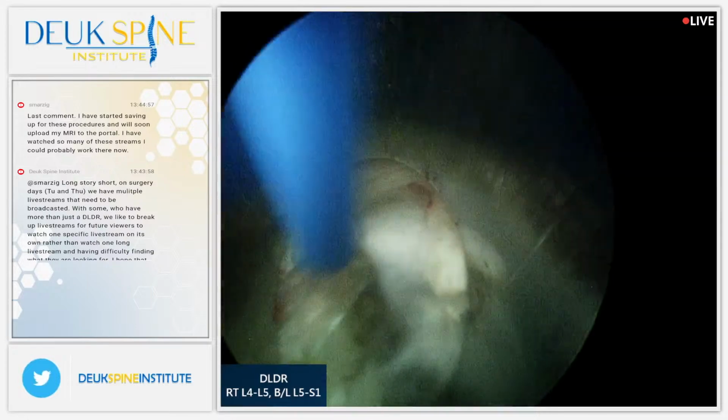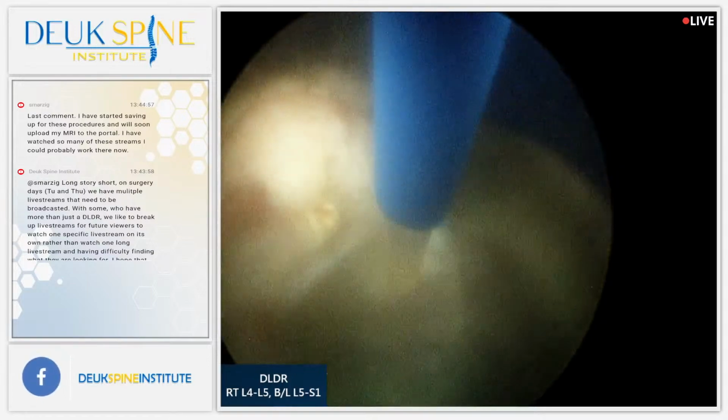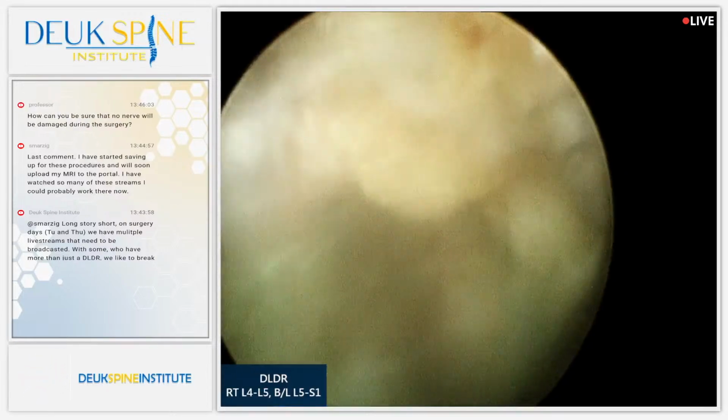all right, we are just about done. I'm just going to clean up this last bit of stuff. Unless I get surprised. Some of this is scar tissue right here.